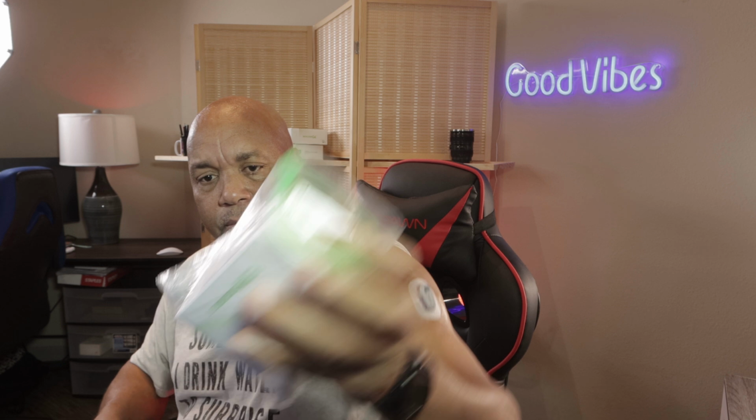You can reuse these. So those of you who, after 10 days, throw your stuff away, no, you can reuse it. And I've shown you in my playlist below where you can make this last longer, up to 30 days. Or you can take it out, put a new one of these on there, and put back these on there, and you're good to go. And save a lot of money, save a lot of money.